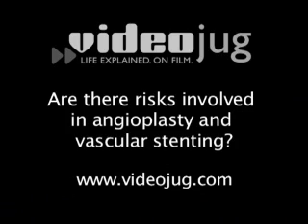In some instances and in certain parts of the body, what's used routinely is the associated use of what are called stents. These are cylindrical metal pieces that provide scaffolding to hold a blood vessel open once it's expanded to an open diameter. Are there risks involved in angioplasty and vascular stenting?